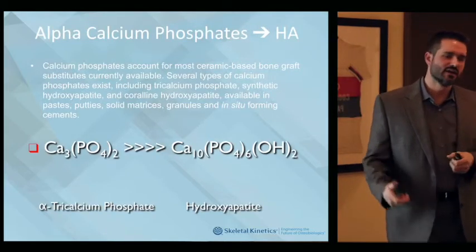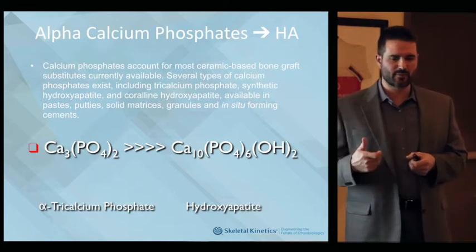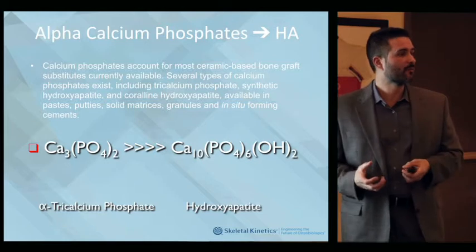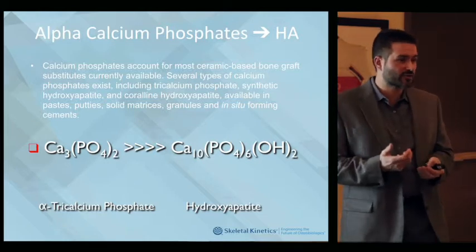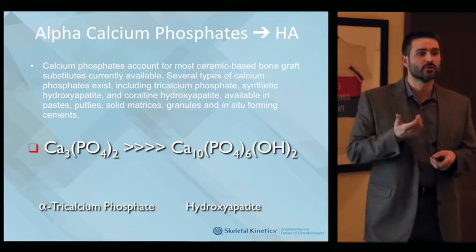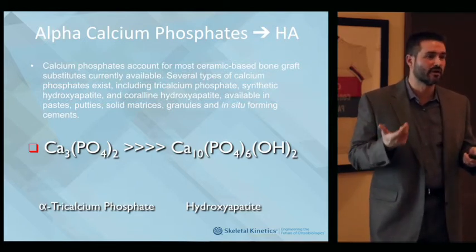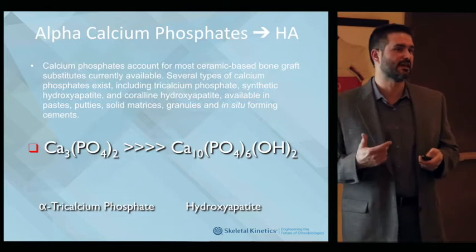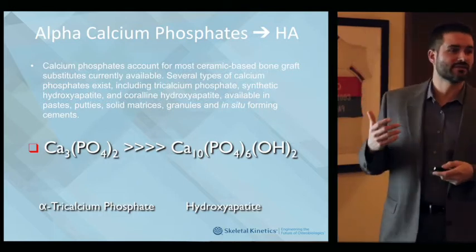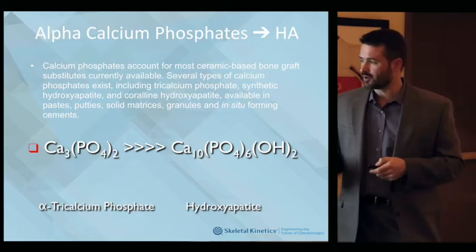Yeah, and it's real easy because the scope's in the knee, or the ankle joint, so that I can make sure, because if you have a subchondral fracture and there's a crack on the floor, the substance can leak through. And we'll talk about that, but I've had no problems with it. I just clean out the joint and I haven't seen anything, and I know other people have done these too, haven't had any issue. But I like to visualize it to make sure.